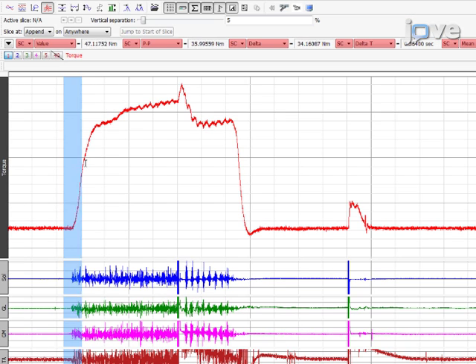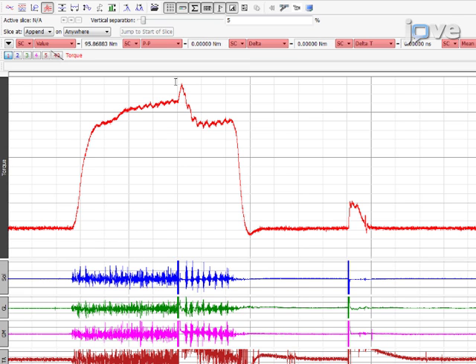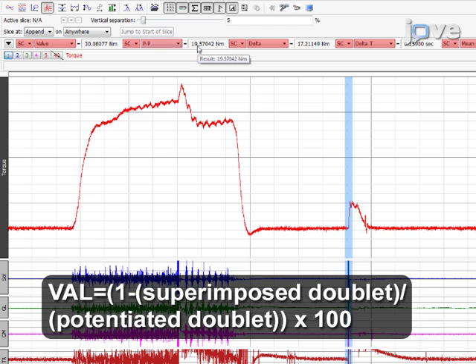Measure the maximal peak torque of the maximal voluntary contraction from the baseline of the torque at rest to the maximal value of the maximal voluntary contraction. Exclude the superimposed torque induced by the doublet stimulation. Then measure the superimposed torque induced by the doublet stimulation, from the voluntary torque value at the onset of stimulation to the peak of the evoked response. Lastly, measure the peak torque associated with a potentiated doublet. Use these values to calculate the voluntary activation level.